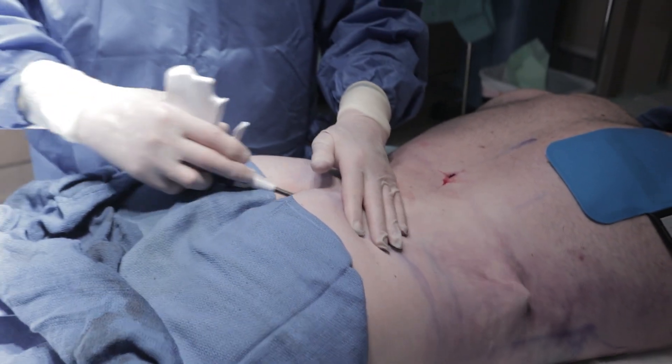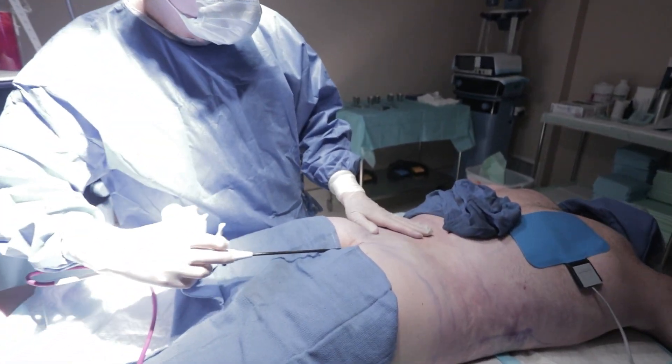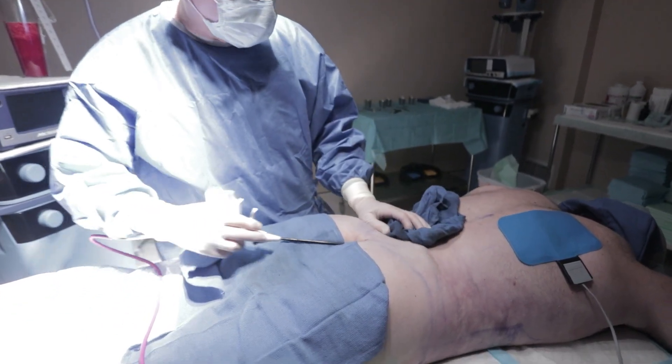So we're doing Renuvion on his lower back.